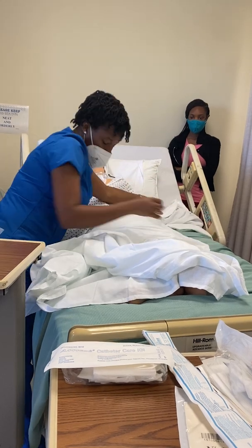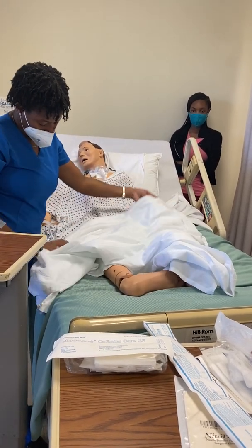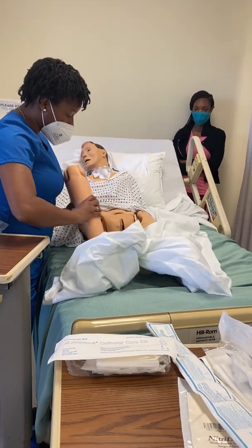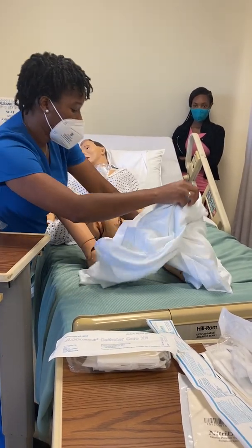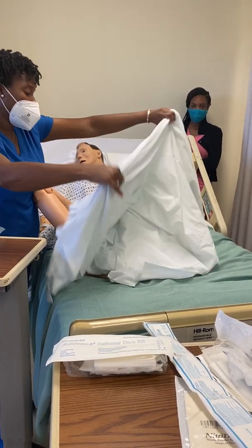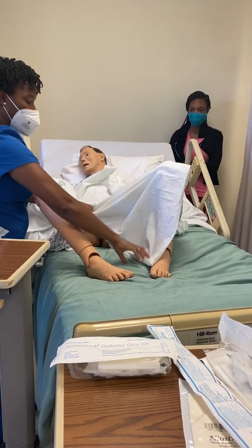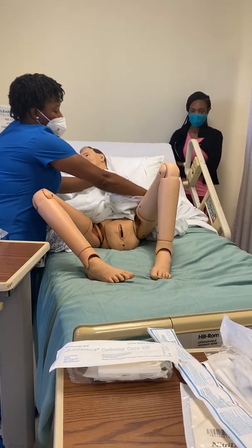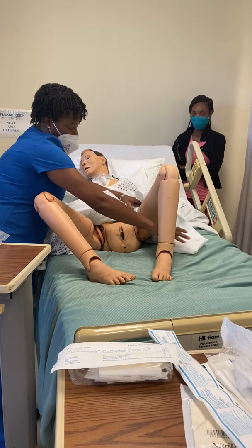And then you're gonna take this with your patient's legs up, and you're gonna drape it over the patient. And you take this portion and throw it back. So in other words, you went through all of that just to drape it back, okay?